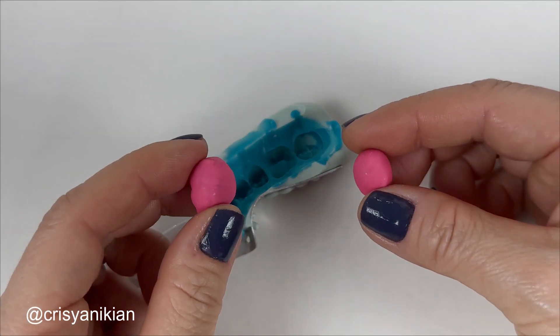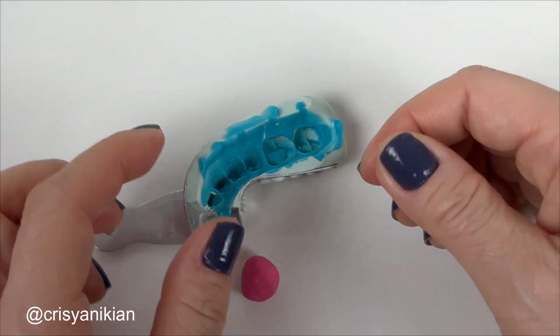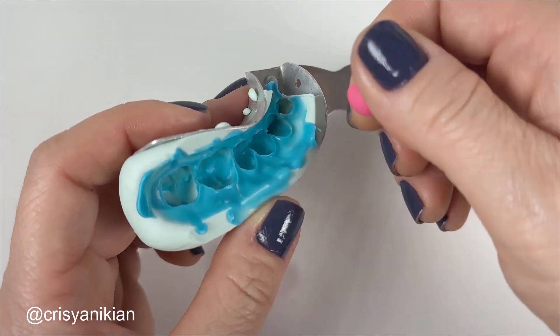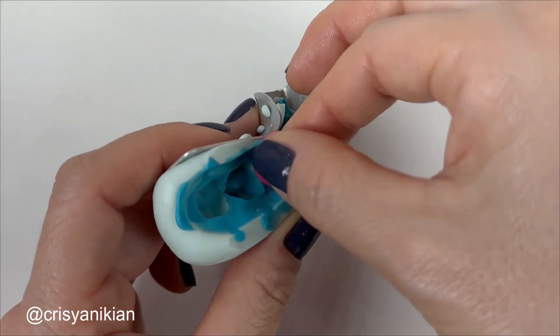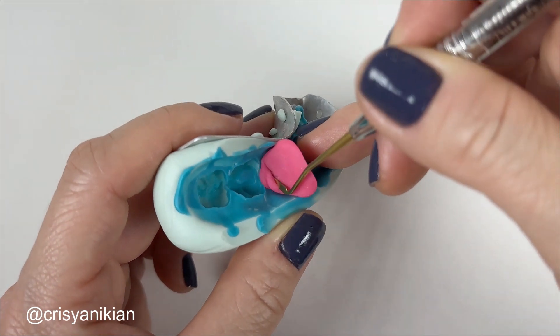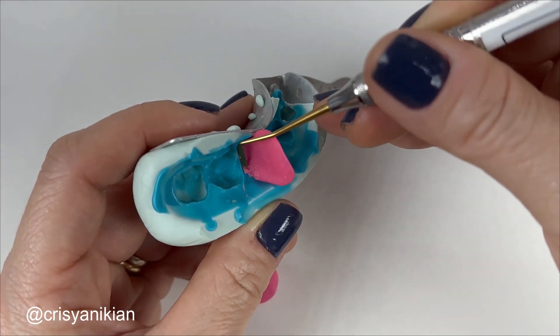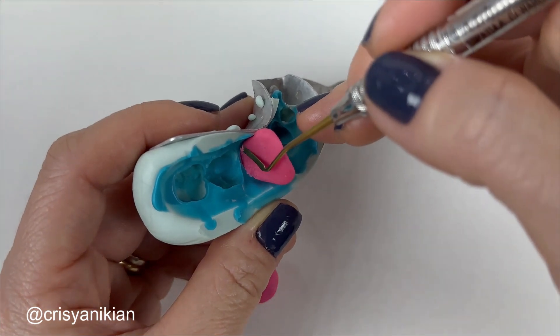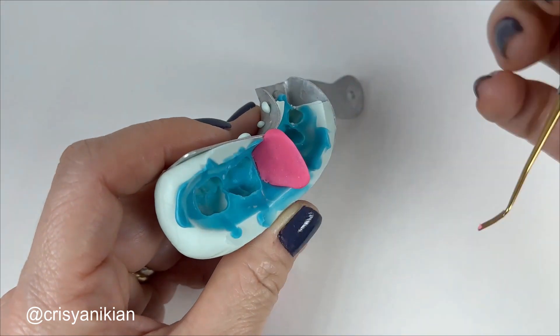Separate the prepared tooth. A simple way to do this is by using modeling clay. Take two small portions and insert them between the adjacent teeth, shaping the clay in the alveolar ridge region to create a barrier. Use a thin sharp instrument, such as a number one resin spatula, to remove modeling clay excess on the prepared tooth — it will avoid interference with the prepared tooth marginal finish.